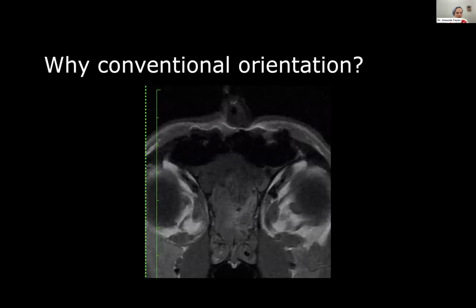When that was discovered, they did go back to surgery and correct the error, but obviously this is a pretty big one to make, and others have been known to have this occur, particularly in back surgeries and hemilaminectomies with an error on the wrong side. Want to make sure you're not doing anything to contribute to that error by incorrectly displaying images or not being aware of how your images are displayed.